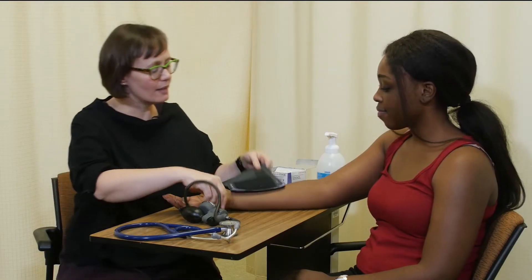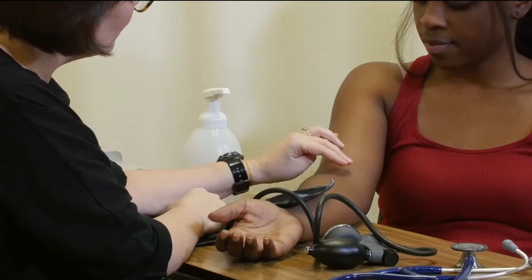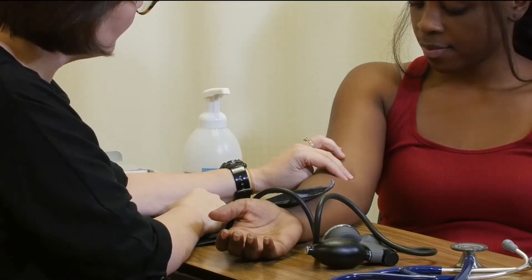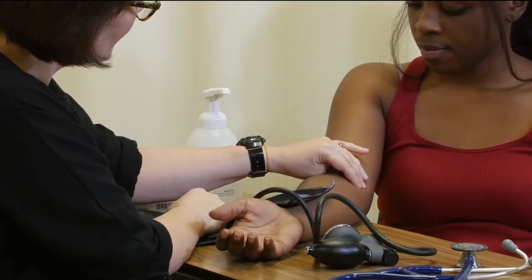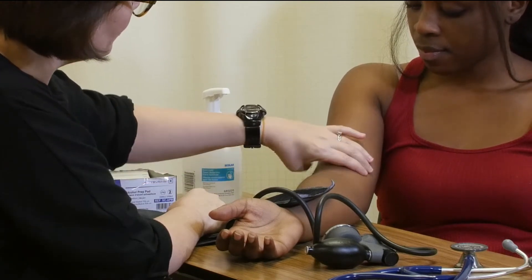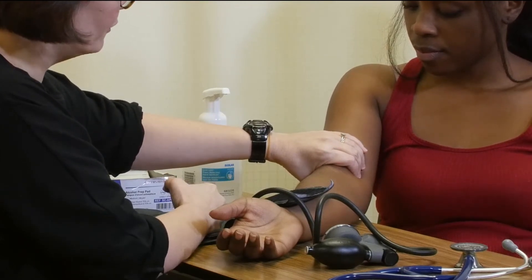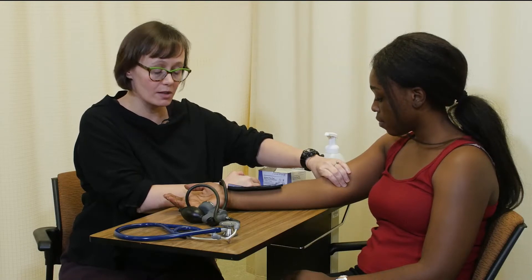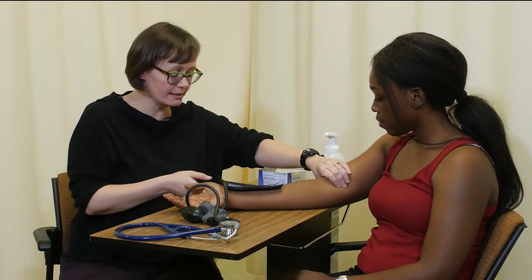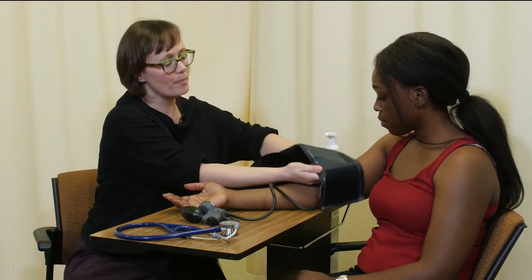So to start with, I'm going to palpate the brachial pulse. I begin by feeling the biceps tendon at the antecubital fossa. I'm going to move medial to the biceps tendon and two and a half centimeters above, and apply a fair amount of pressure to feel for the brachial pulse. I've located her brachial pulse so I know where her artery is, and I want to apply the cuff's artery line right on top of that artery.